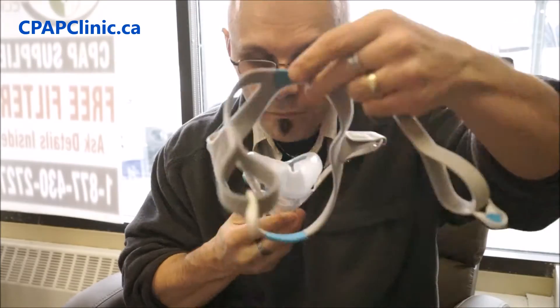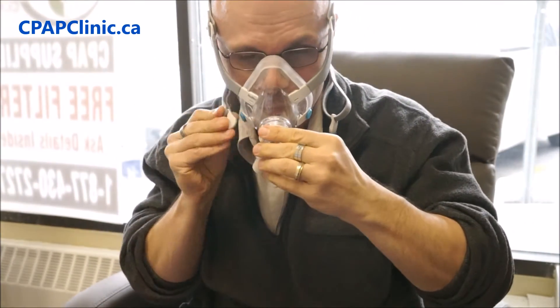Next thing I noticed was how fast it went together. The magnetic clips went on so quick and easy it made me wonder: will this thing stay on during sleep? Any amount of usage at night will be able to answer that question. My guesstimation is yes.